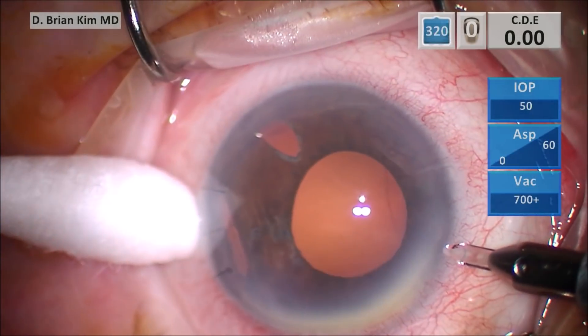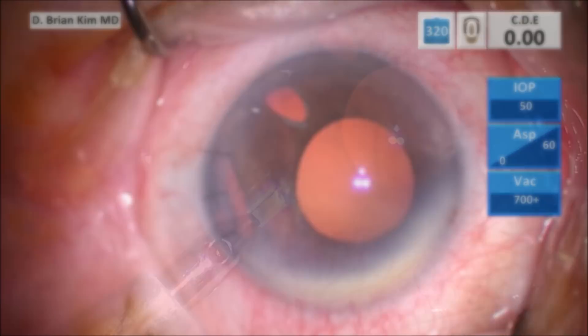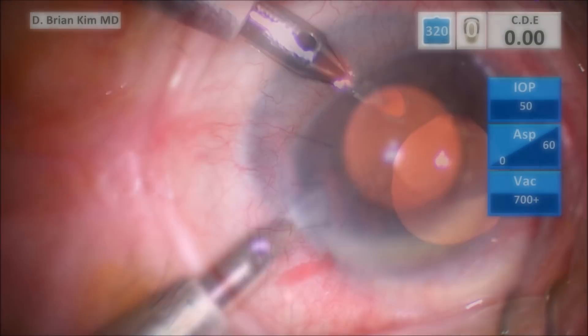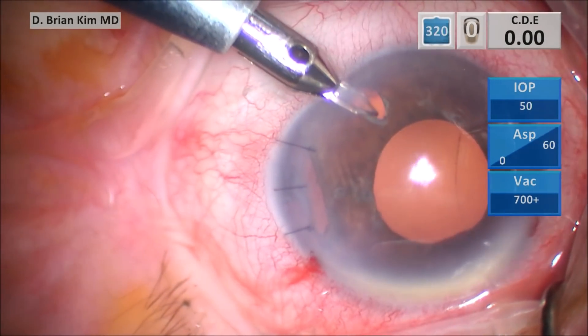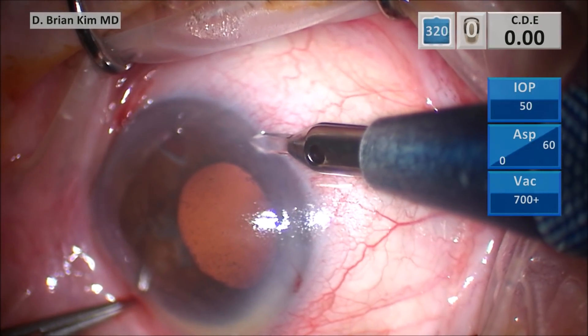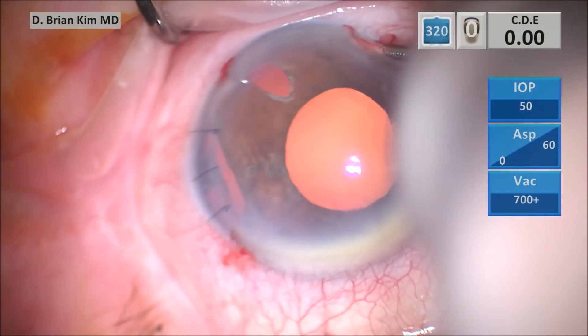Every good surgery starts with good preparation. I'm making my incisions, slightly supratemporal and supranasal. This is my inferior incision to externalize the leading haptic, and this is my incision for my AC maintainer. I am sitting supertemporally to do the surgery.